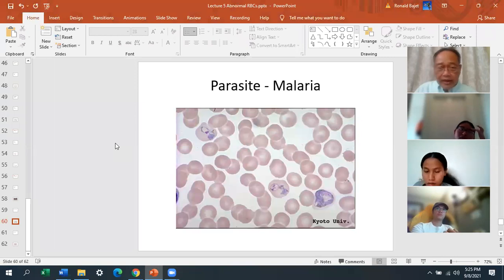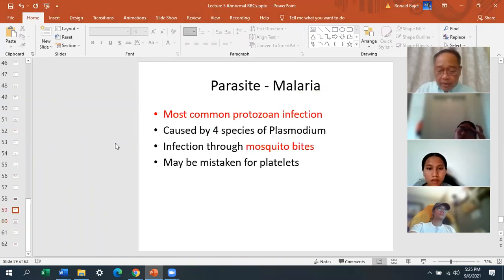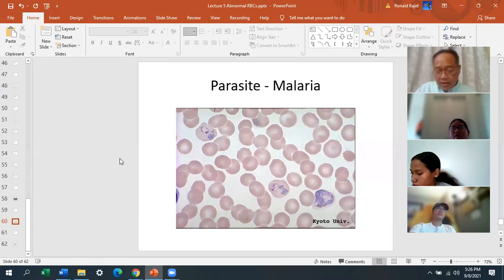This one here, the next slide. Oh my goodness, I thought I had more slides of malaria. Okay, so you get a ring form here. In micro, you'll see more malaria slides. But there's a ring here and a ring here. I apologize, I thought there was a better malaria slide.